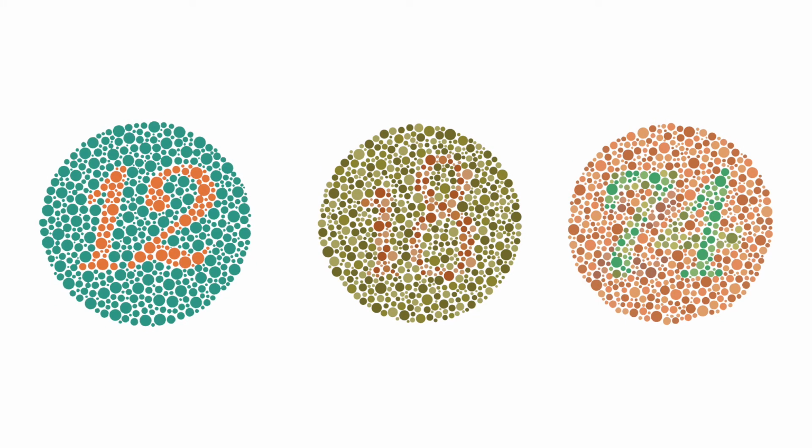Commonly used color vision tests such as pseudo-isochromatic Ishihara-type tests use confusion colors to identify red and green color deficiencies and have limited ability to grade depth of deficiency. Additionally, most pseudo-isochromatic tests do not test for blue-type deficiencies, which are rarely genetic and are more commonly acquired, affecting up to 15% of the general population.